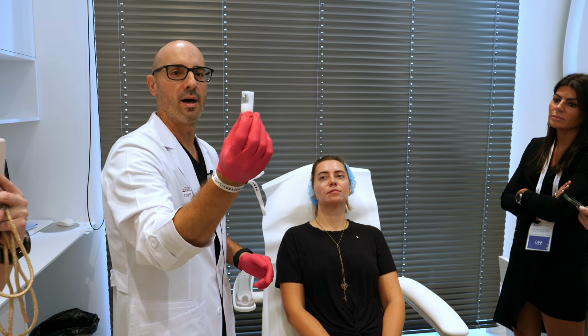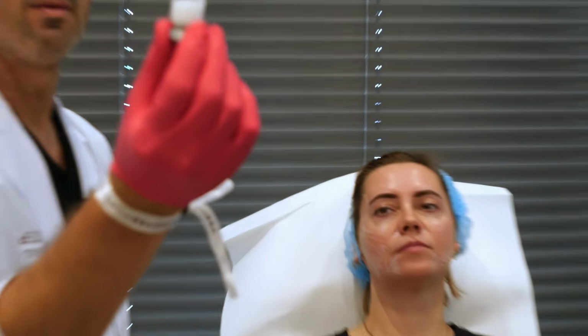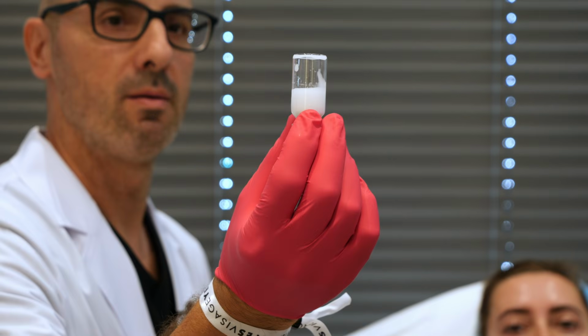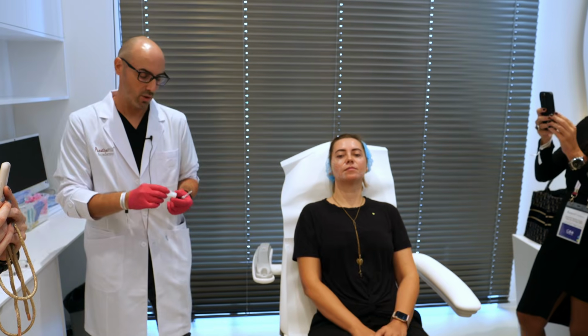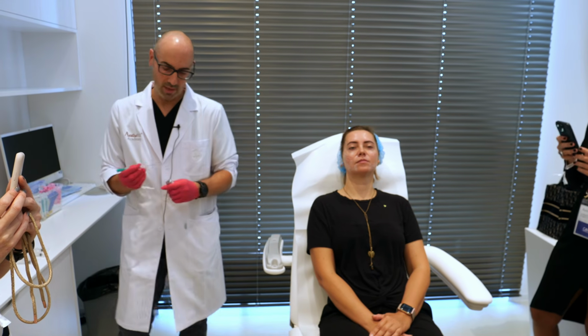If you wait a few seconds, you can see no residue in the vial, okay? And just now, we put lidocaine, in this case, 5 milliliters of water for injection and 1 milliliter of lidocaine 2%.